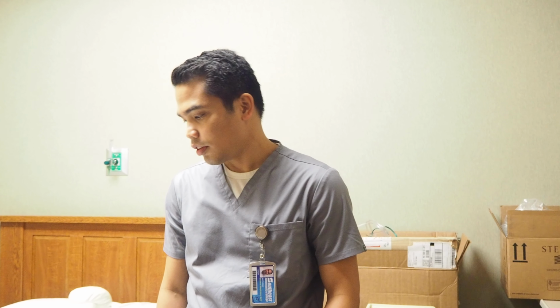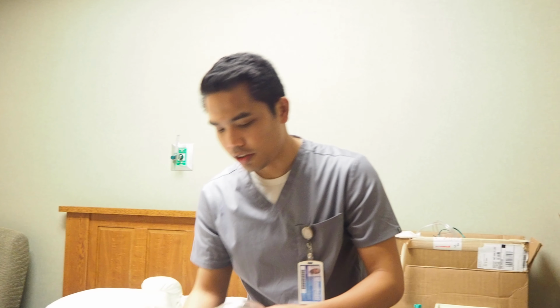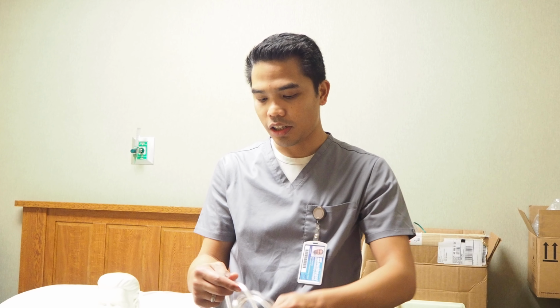Hi, good morning. I'm going to perform an auto scenario. So I just got called from the station that the physician would like the patient to be hooked up with a nasal cannula.